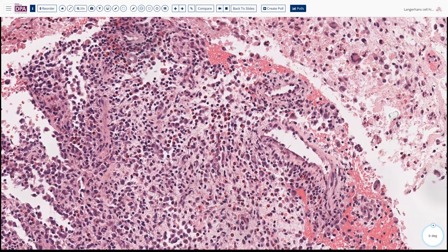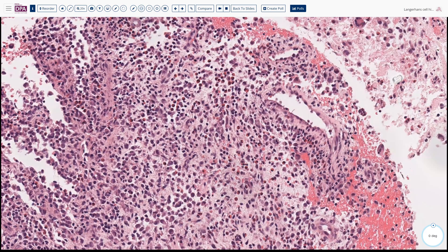At higher magnification, some of these cells have identifiable grooves in the nuclei. In addition, there is a significant backdrop of eosinophils — not neutrophils, no other inflammatory cells per se. This is a nice suggestion that this may be what was originally termed eosinophilic granuloma of bone.